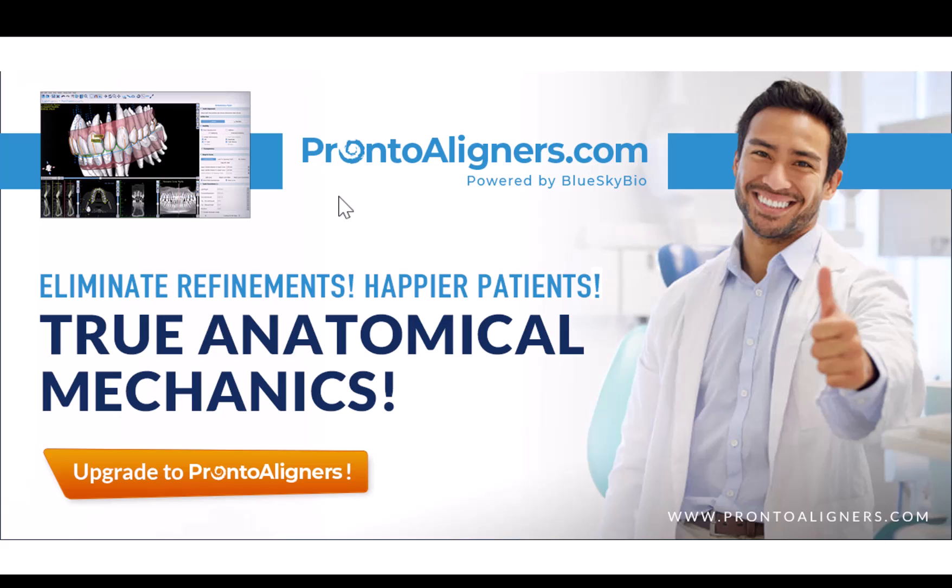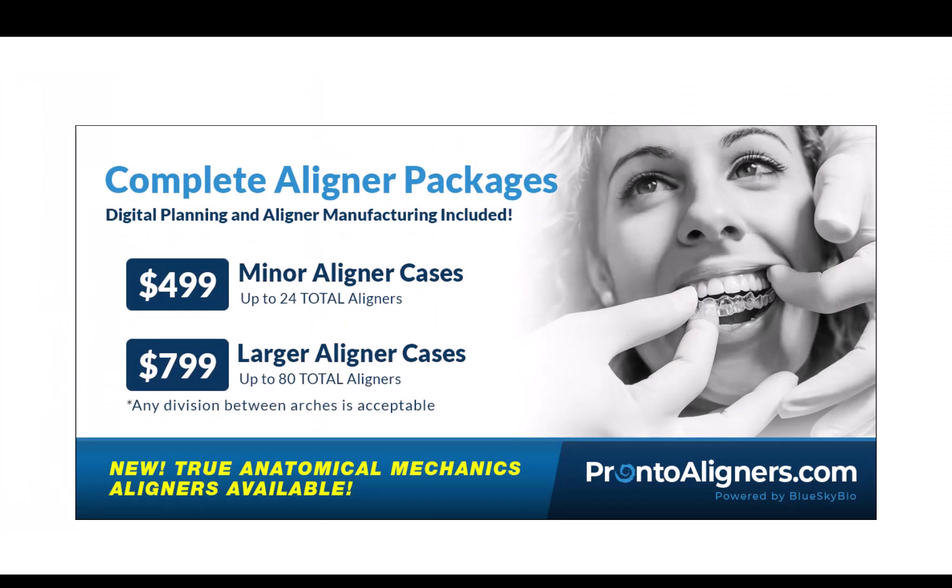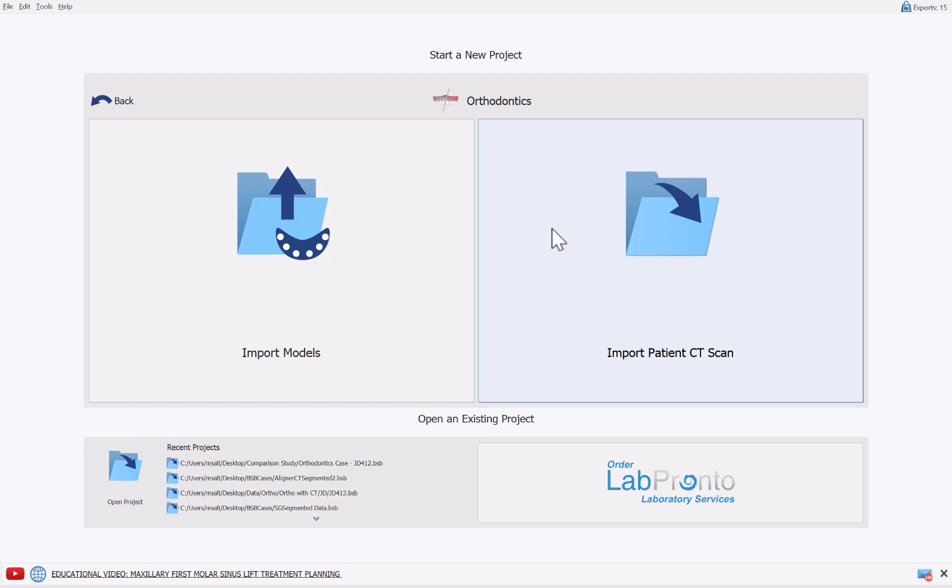You can see more information regarding this at ProntoAligners.com, and if you are outsourcing your aligner manufacturing, you can order aligners at fantastic prices. Now we're going to jump into the process flow by clicking on import patient CT scan.